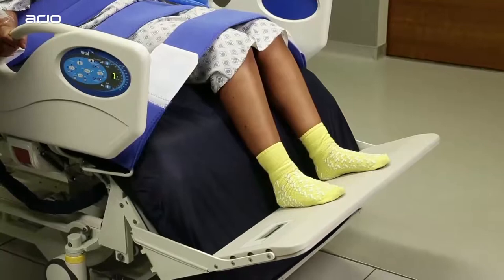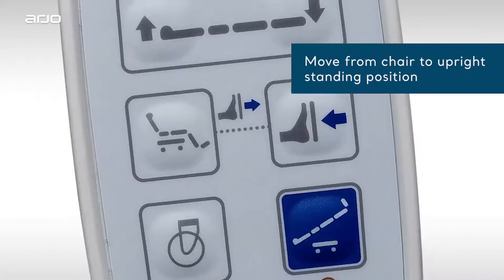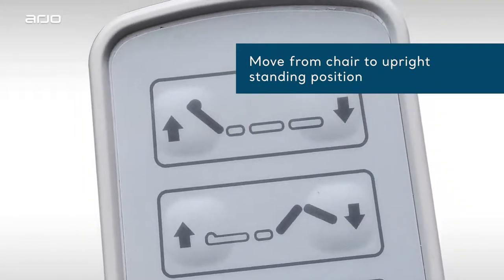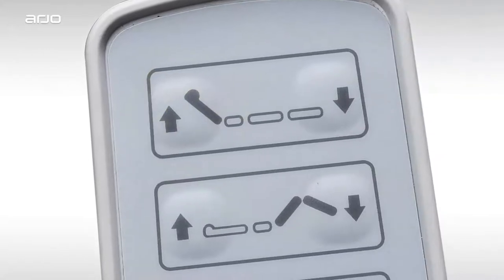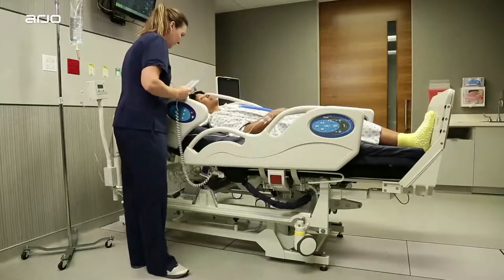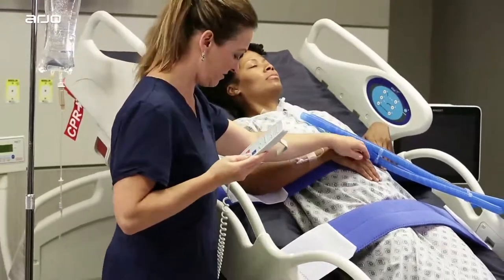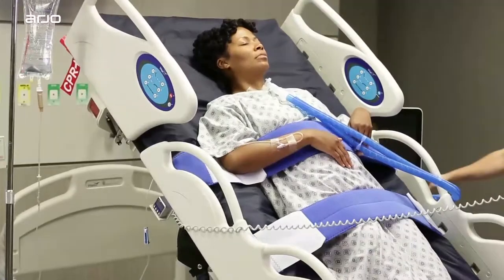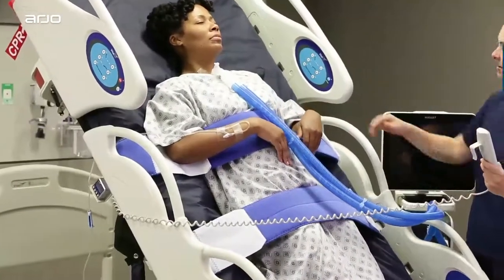Two beeps will signify the end of the motion. If you want to place a patient from the chair to a standing position after unlocking the tilt function, all you need to do is press the tilt button. The Total Lift Bed will first flatten, then go into the upright standing position. Please note, you cannot place the bed into the chair configuration directly from the upright standing position — the bed needs to flatten first, then go into the new position.